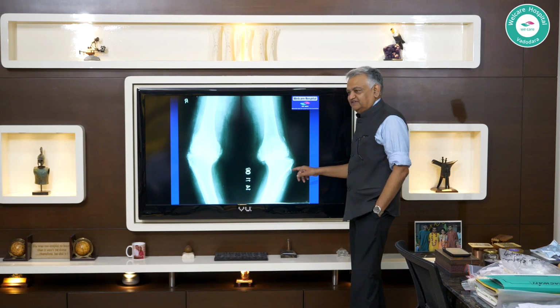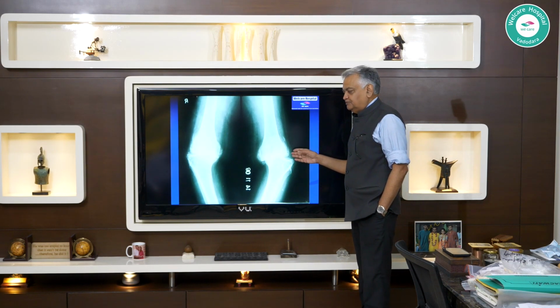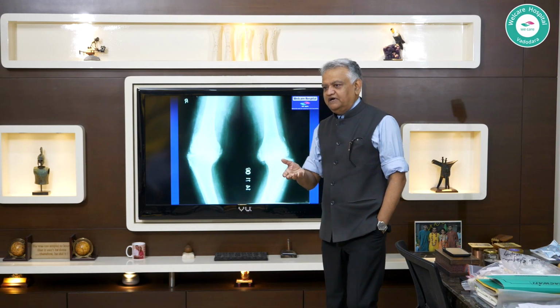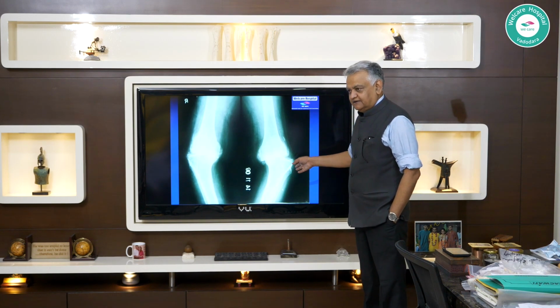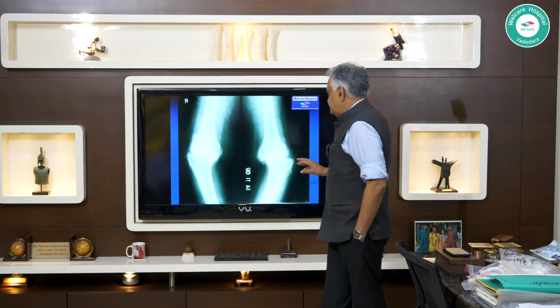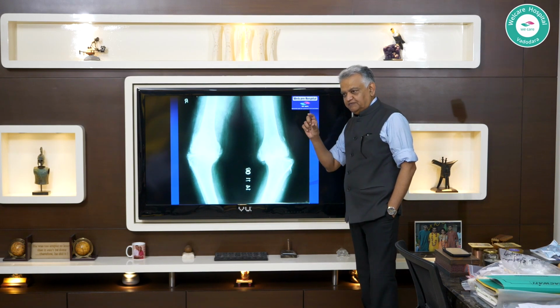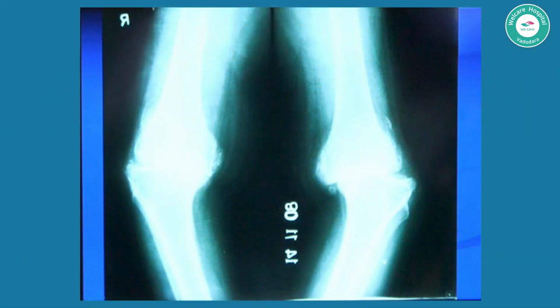So one thing, the stretched out lateral structure, which Kshitij mentioned. How is it a challenge? The challenge would be you cannot contract the lateral structure. So the only thing you have available is to ensure that you open up the medial side well enough for you to balance it out, and that balancing both in extension and in flexion. So one is I would be aware that there is likely to be a mismatch in the medial space of my extension and flexion gaps as compared to the lateral. Number one. Number two, the popliteus thing that I said.